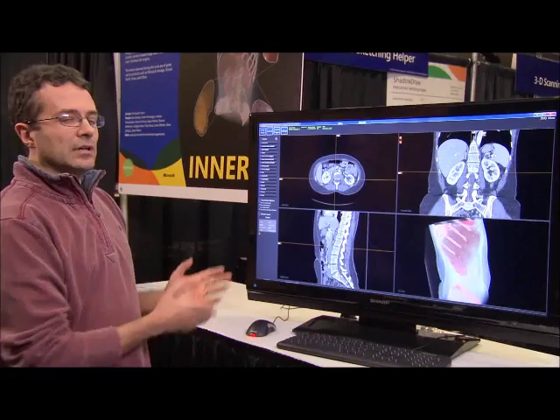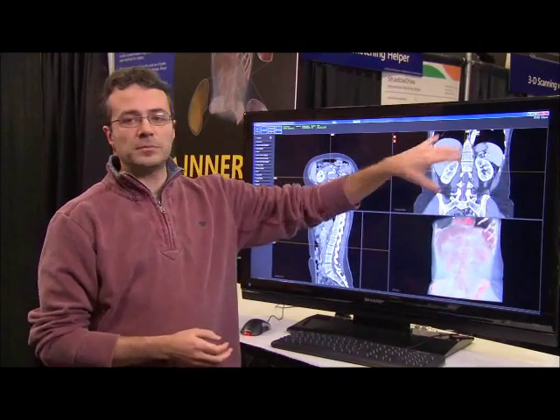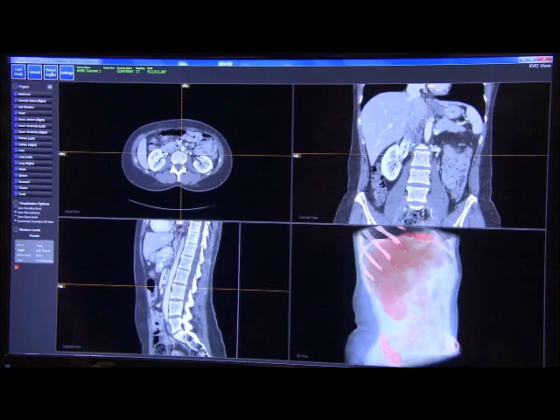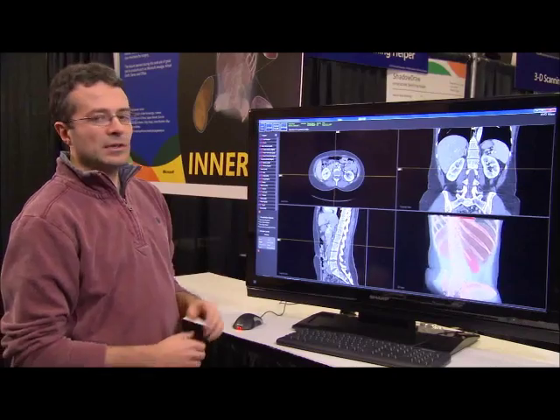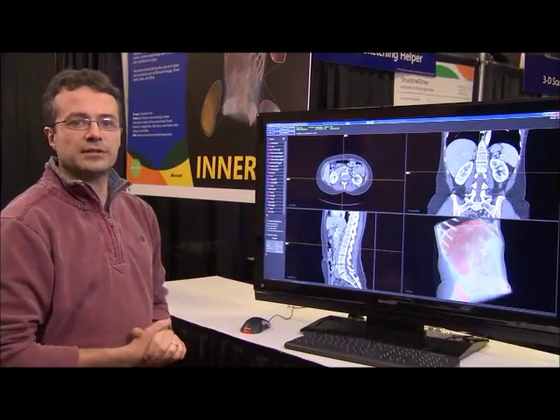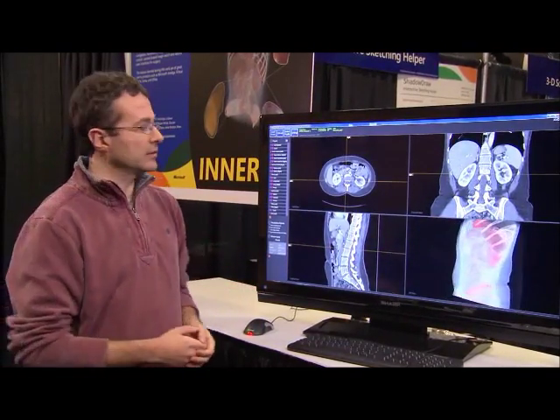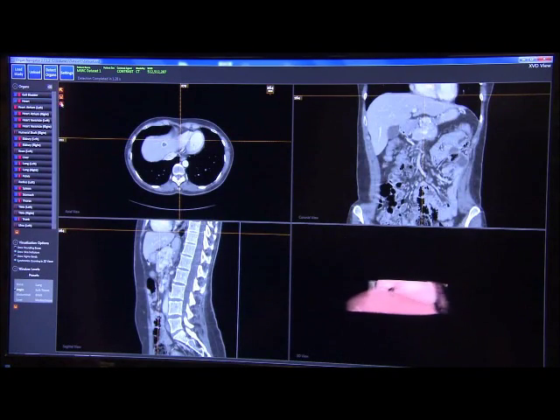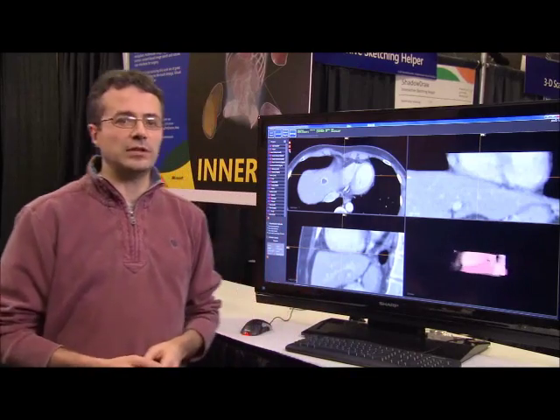Now what the NRI project allows you to do is automatically figure out where all the major organs are. I'm going to click on a button here which says 'detect organs' and in about a couple of seconds the computer now knows where the heart is, where the liver is, and the spleen. So if I'm a cardiologist and I'm only interested in the heart, I just click on the heart and I get a nice optimized view of the heart on which I can do diagnosis.